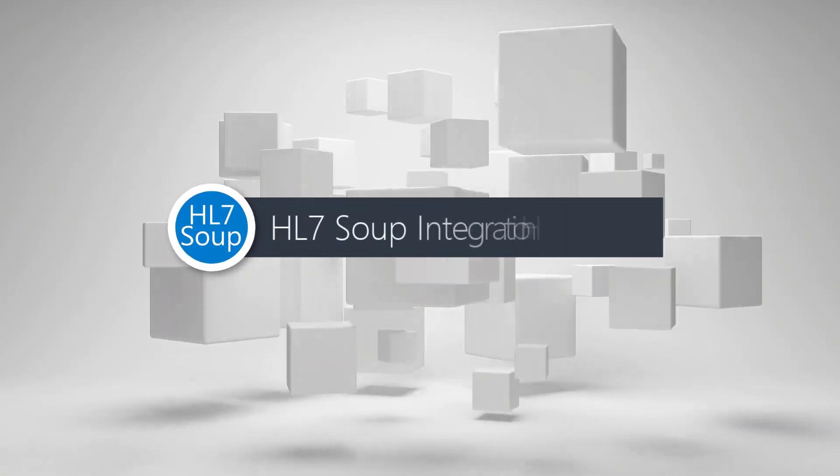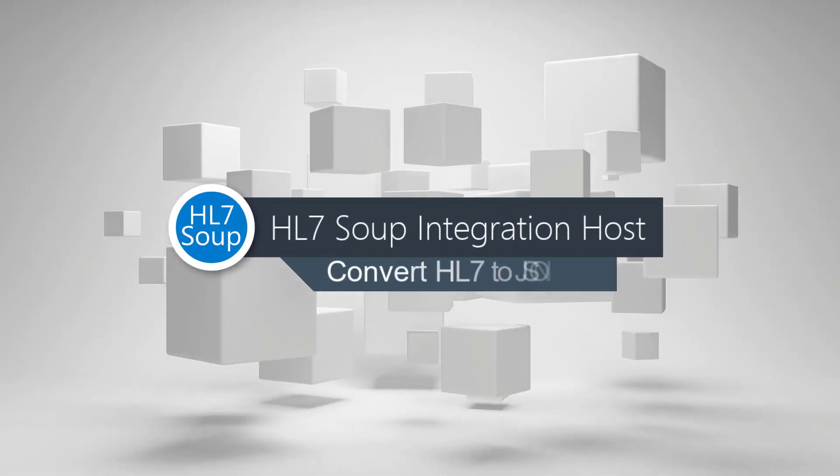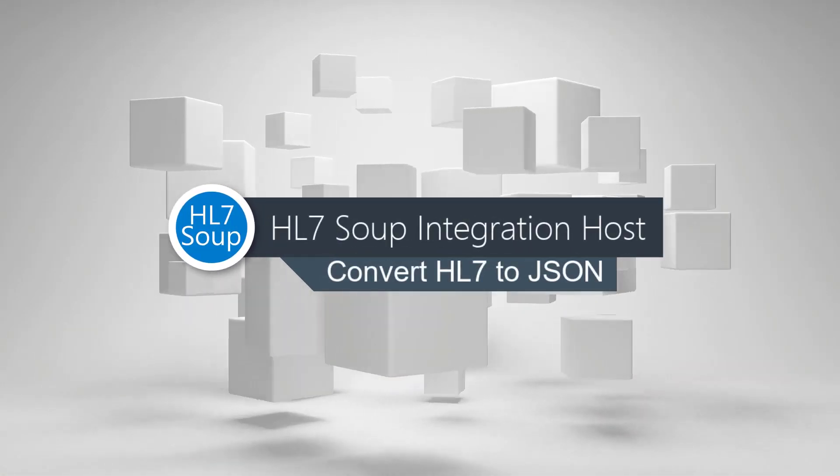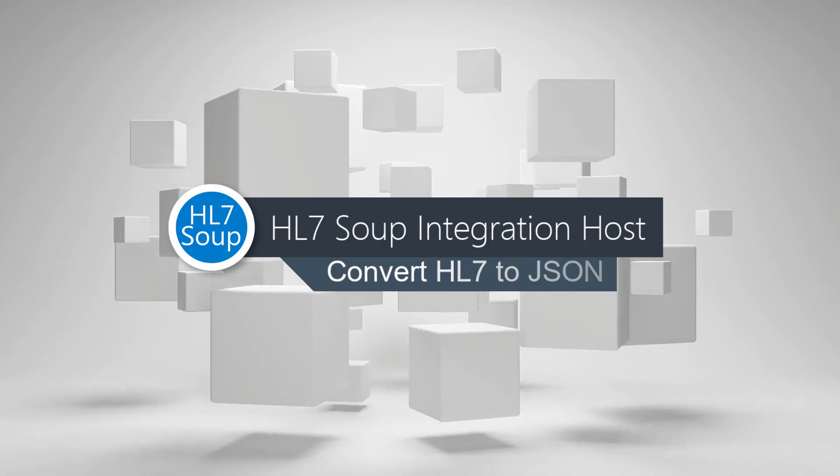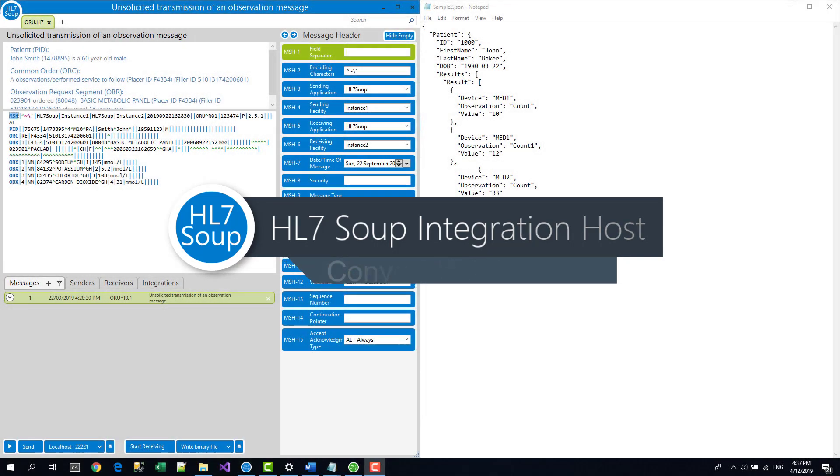Hello and welcome to this tutorial where we're going to show you how to convert an HL7 message into a JSON file.